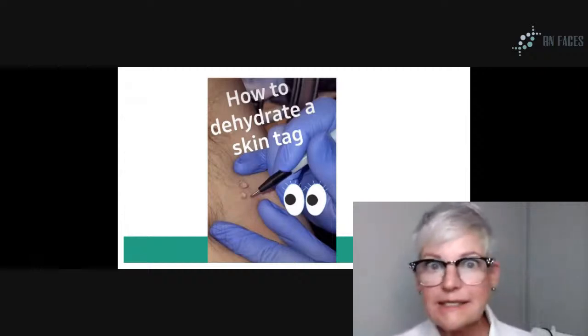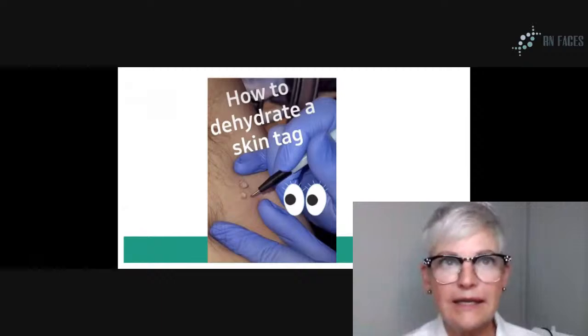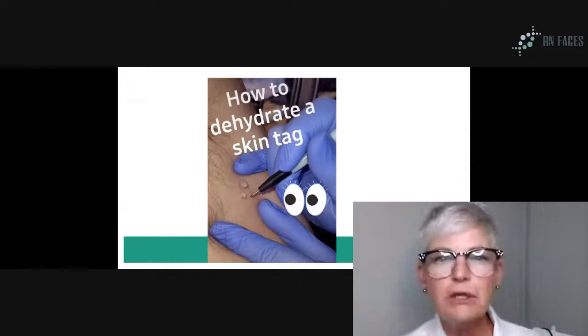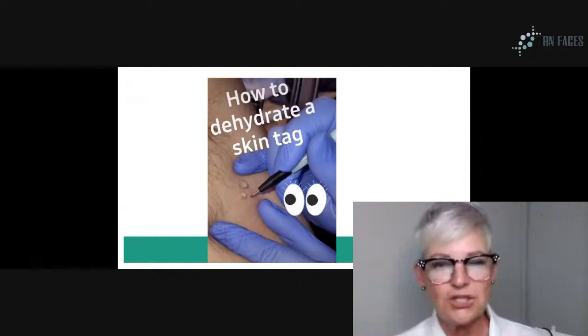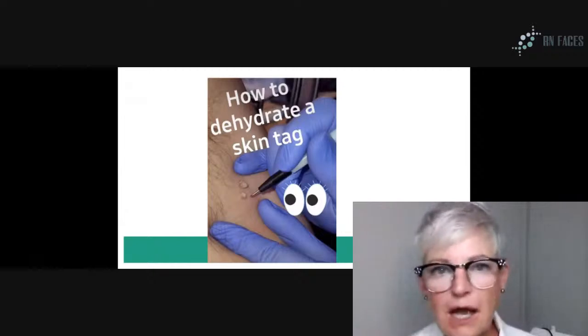I can't really tell you exactly how many seconds, but I like to hold it, hold it, hold it. You'll start to see it blossom. And as you do, not just the first little speck that you see, but you really want to dehydrate it from the top inward, so that when you go and start tapping and touching around the bottom of it, the stalk, it will really be truly dehydrated.